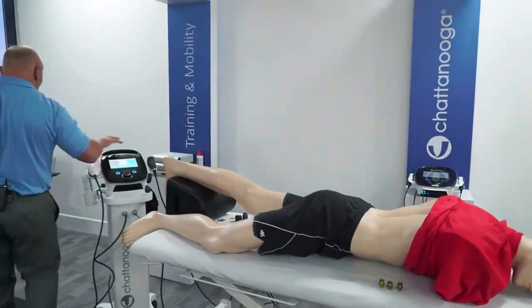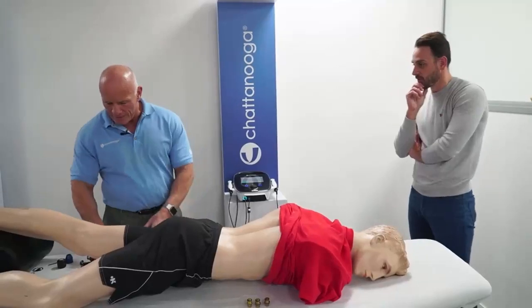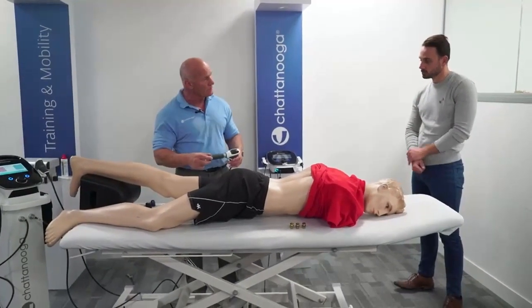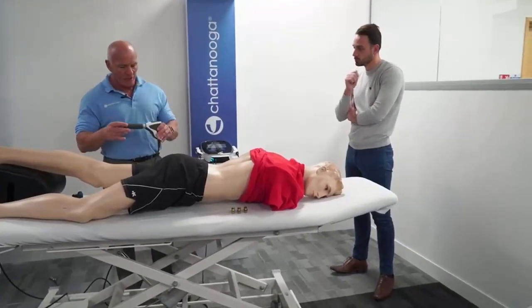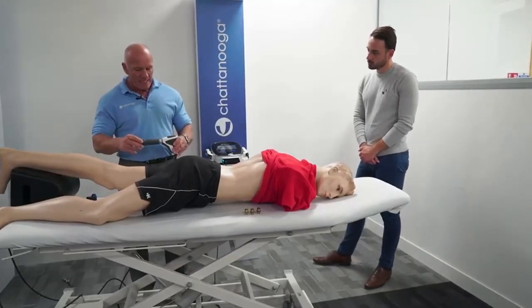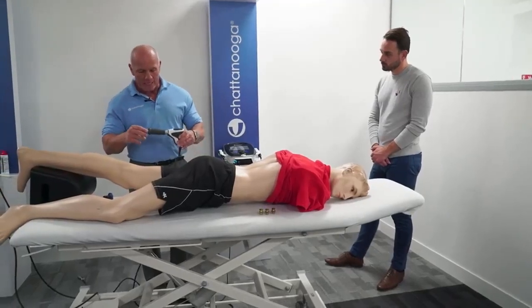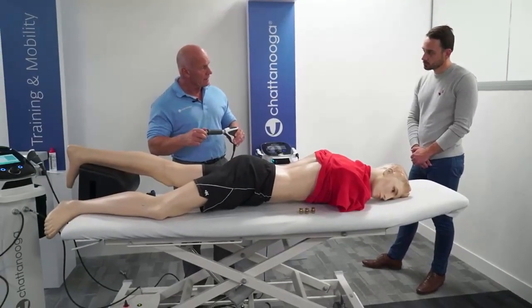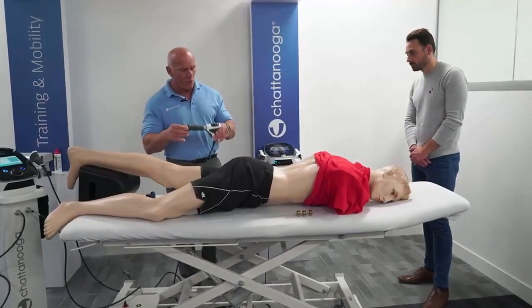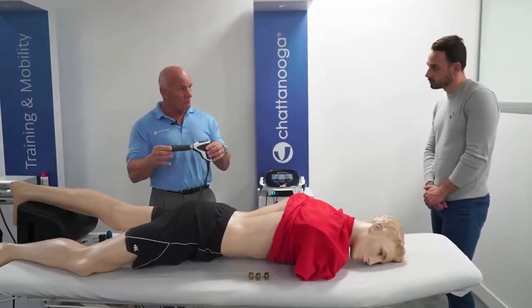And in terms of cleaning the unit, how do you clean it after you've used it with a patient? I'm glad you said that, because that's such an important part. The life of your handpiece will be significantly elongated if you get into the habit of cleaning your handpiece daily. So this, to me, is the Rolls Royce of handpieces. And just like a Rolls Royce, it does need looking after.